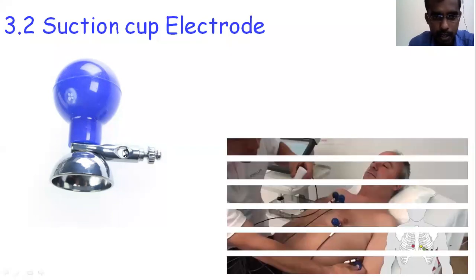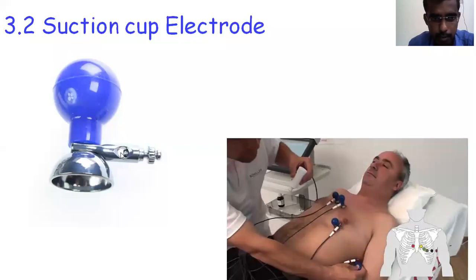Here is where your probe wires connect and take the terminal. This is to make the suction. Once you press it and release it, it sucks and attaches. You can see a real-time picture here. This elderly senior citizen has suction cup electrodes attached. They place them at these places. I think they are trying to get an ECG.